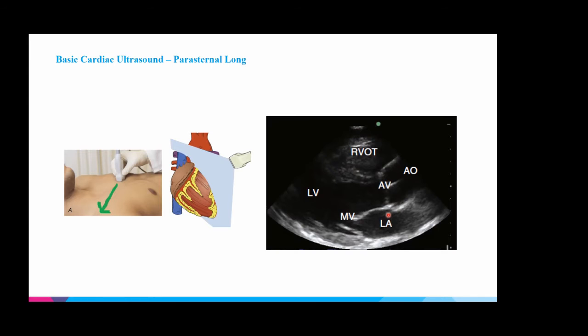And so, with point of care ultrasound, we're trying to get the main things to help us with our diagnostic workup, whether we're assessing a patient in shock and we want to know, is this cardiogenic shock, is this septic shock. Some of the main things we look for in this view is LV function, right? Is the function reduced? Is it normal? Is it hyperdynamic? I'll probably go over how to assess that in later lectures. But we're really trying to get generalized views of the heart.